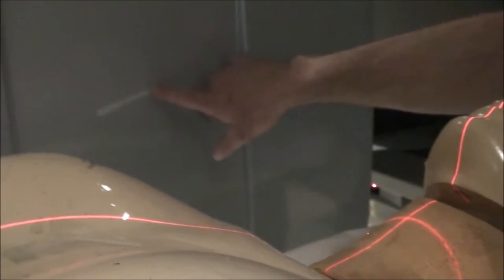I have ballparked this without even turning the collimator — I have flash right now. If you do not turn the collimator, your flash is going to look like a little bit of a wedge. If you turn the collimator, as we discussed in class, there are two ways to do it — you can have either a collimated larynx or not. I'll drop the patient just a little bit so that you can see more flash — you'll have flash running evenly across the top of the neck.